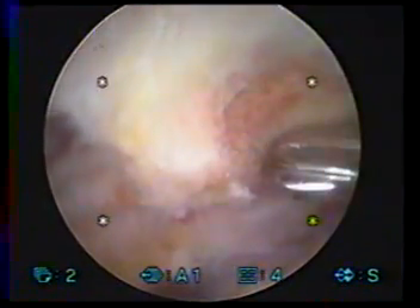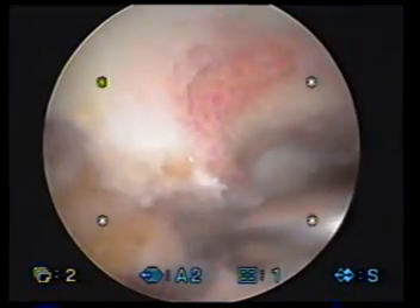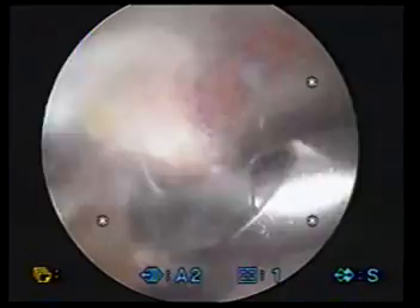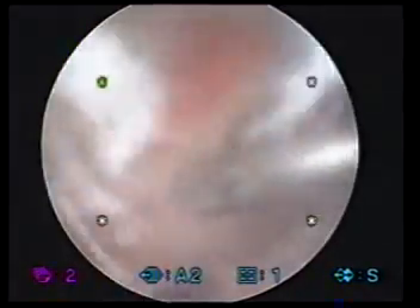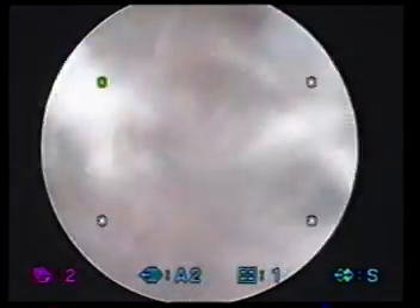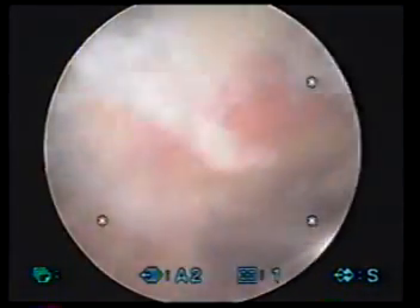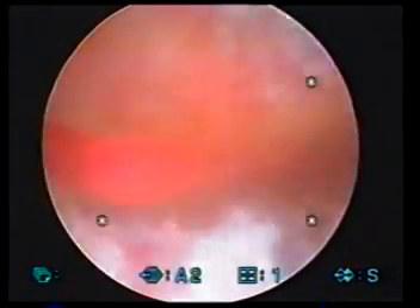Here's our bone spur here on the undersurface of your shoulder cap. We're going to smooth and flatten that off now, just coming right up underneath with this burring device, just flattening that off. As we do that, what will happen is your body will have room to heal this rotator cuff. And more importantly, nothing will be abrading the rotator cuff down the road. You shouldn't have any possibility of recurrent rotator cuff tearing down the road.